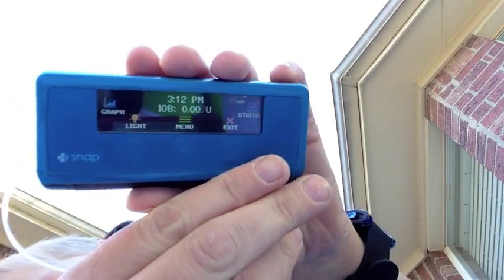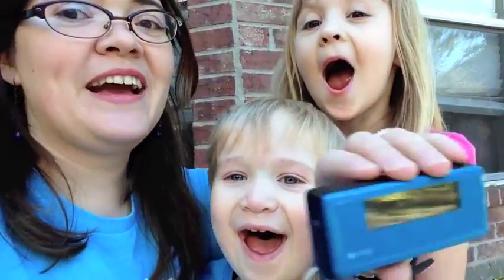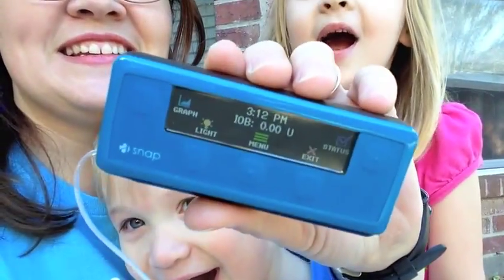There's the screen again — a little bright in daylight. And this is MySnap.